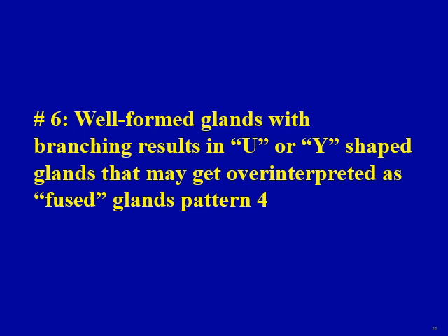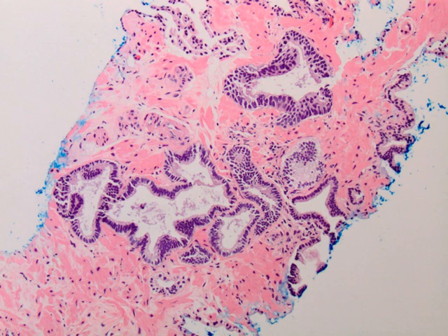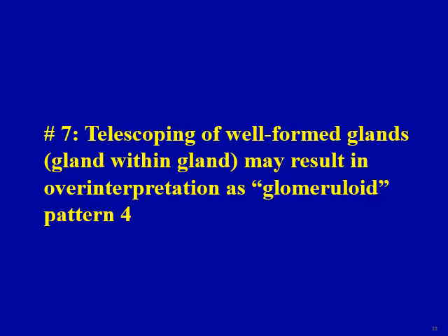Pitfall six: large well-formed glands may result in U- or Y-shaped glands that get over-interpreted as fused gland pattern 4. Here is an example — these are well-formed large glands showing a branching pattern; this is branching, not fusion, and would be graded as 3+3=6. Pitfall seven: sometimes you may see telescoping of well-formed glands, also referred to as gland-within-gland, which may result in over-interpretation as a glomeruloid pattern.